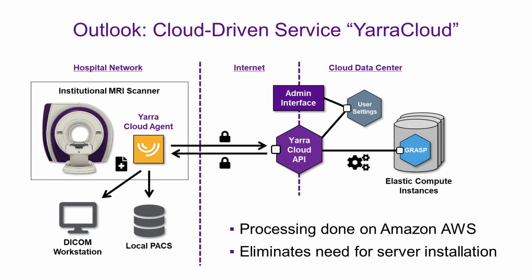And just as a quick outlook, we recently also developed a cloud-driven service for Yarra, which seamlessly integrates into the Yarra clients. And with YarraCloud, the reconstructions are then performed on cloud instances using a pay-per-use model. So in this case, you don't have to install and maintain your own Linux servers anymore. And this means it also automatically scales with your institutional demand.